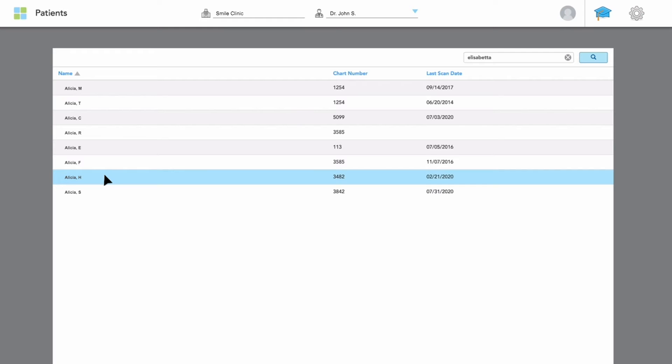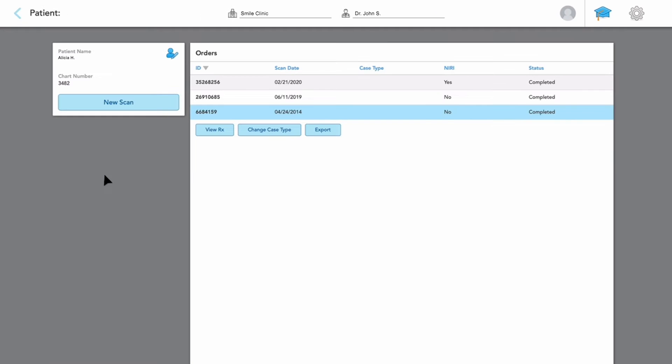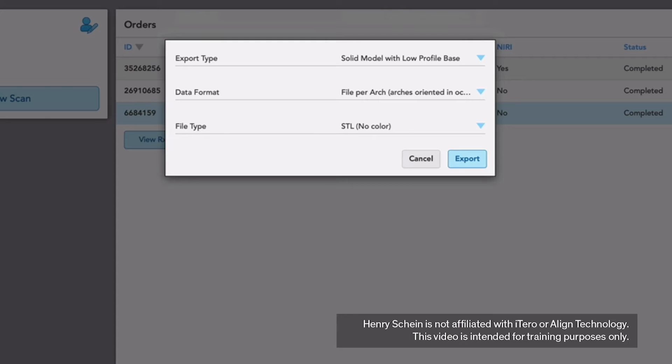Click on the patient's name. Click Export. In the Export pop-up window, select the following options.